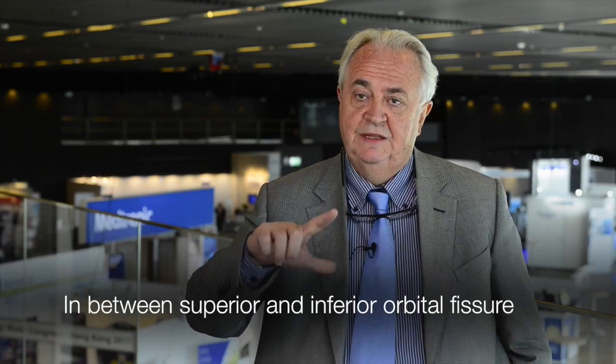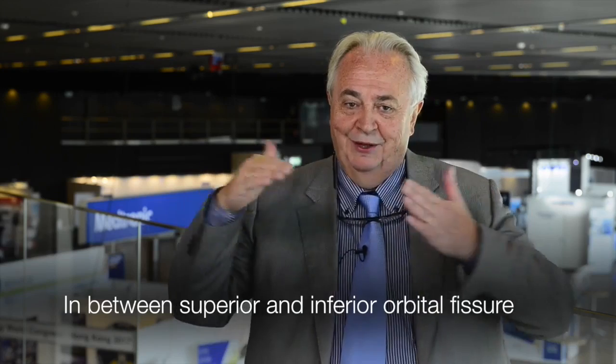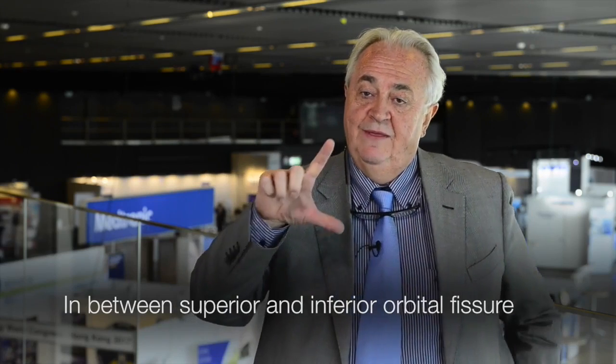A different approach is to use the orbit as an additional port for skull-base surgery. And we use the same anatomical landmarks, same procedure for approaching the orbit. So, superior eyelid incision, very cosmetic. When we are inside the orbit, we know that in between the superior orbital fissure and inferior orbital fissure, which are very clear because the periorbita goes inside, there is the greater wing of the sphenoid.